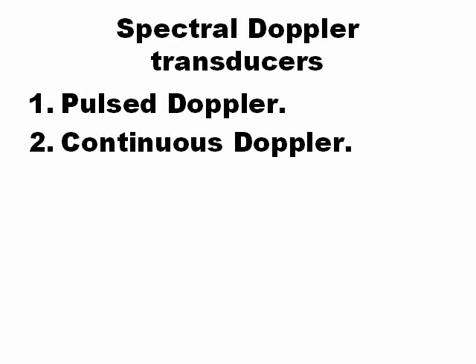A spectral Doppler transducer: the pulsed transducer is the same transducer that we use to scan in normal B mode. And the other kind of transducer is called continuous Doppler. We don't use the continuous Doppler transducer in general sonography, but in vascular and echo sonography it has a lot of use.